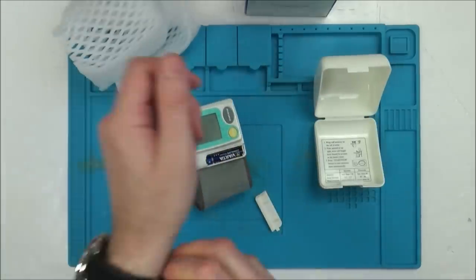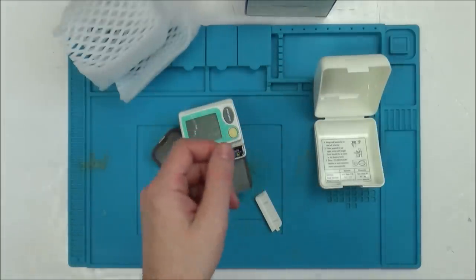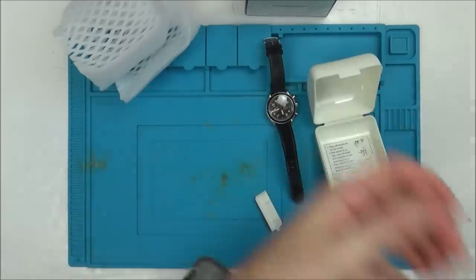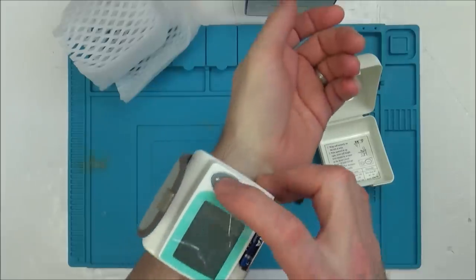So the display came on there. Let's just take off my watch and let's go.